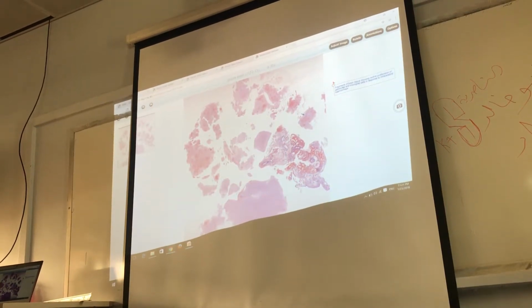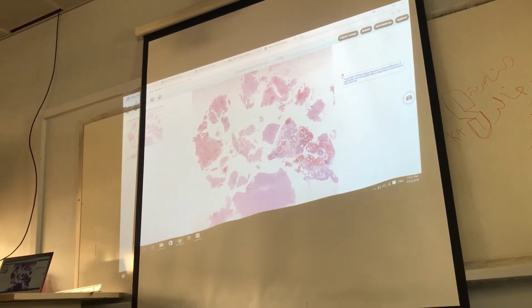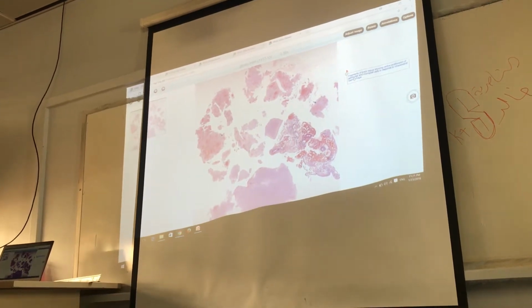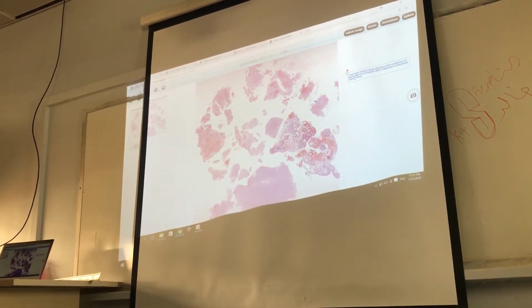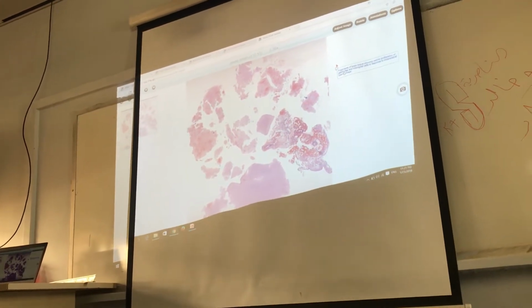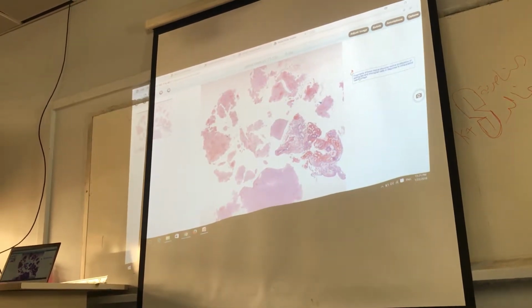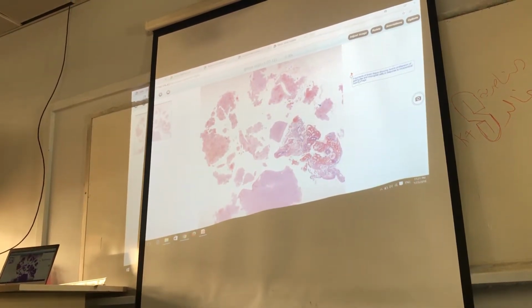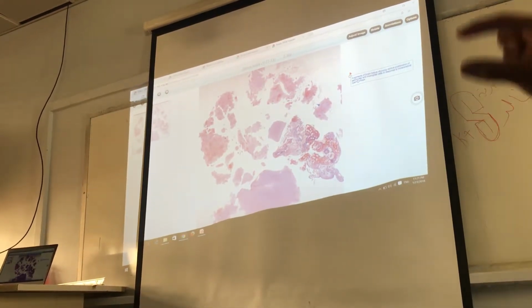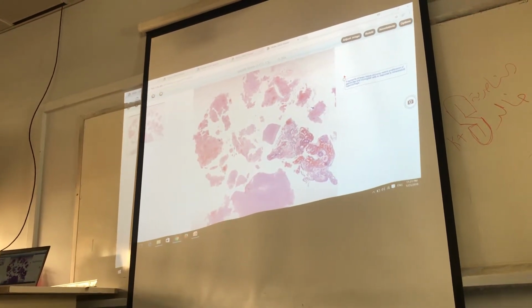So fragments of brain tissue showing reactive gliosis. This is about reactive proliferation of astrocytes. What is the cell responsible for repair? Astrocytes. What happens to the morphology of astrocytes in repair? So this is what we would like to see. What happens to microglia at the site of hemorrhage? They become nodules, they will enlarge, elongated. So this is what we will see here.